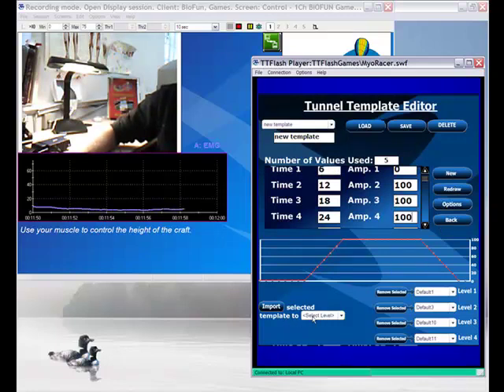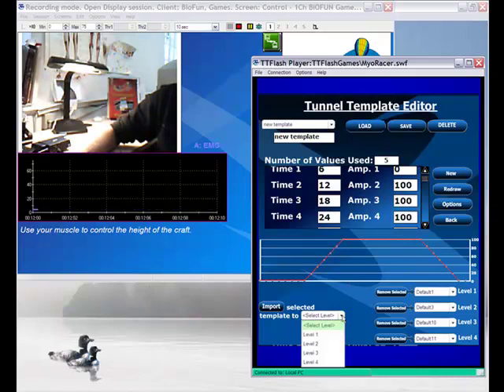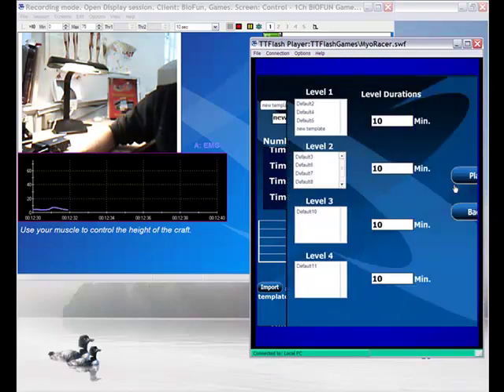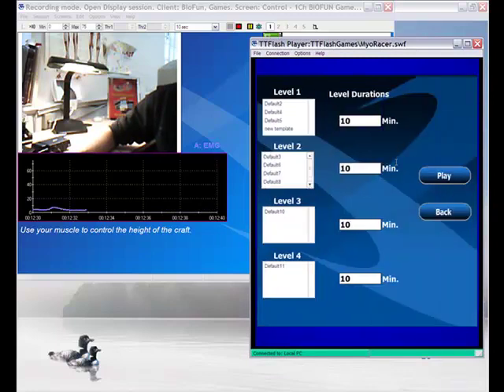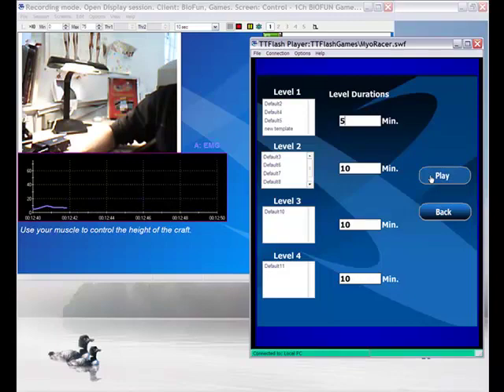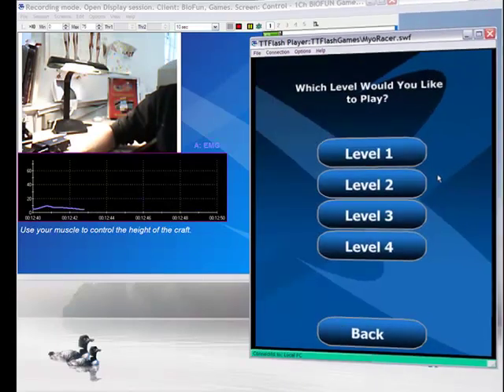After that we have to assign it to a level. So I select a level. Level 1 for instance. Okay. And we press import. After that we can change. We see that new template is in level 1. And we can change the level duration. And back to play.